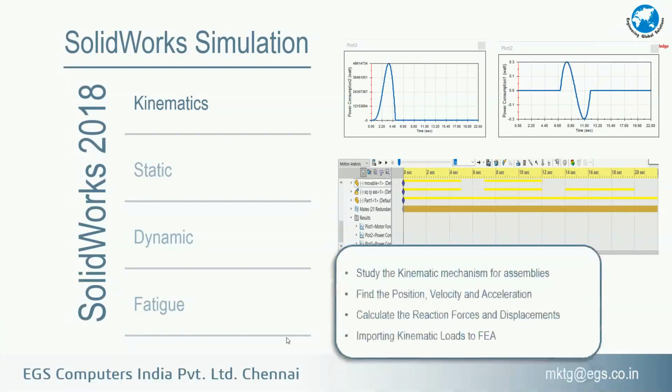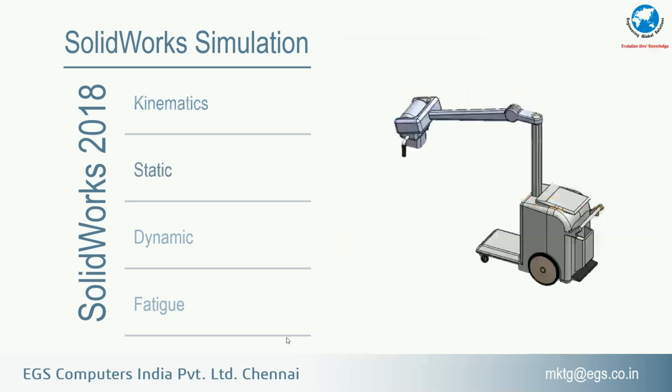So in the kinematic study we can study the mechanisms and we can find what the position or angular velocities are, what the accelerations are. We can also import this for finite element analysis, where we will find the stress distributions or concentrations on the mechanism when it is in the operating condition.